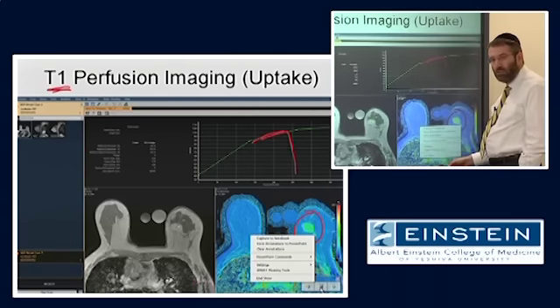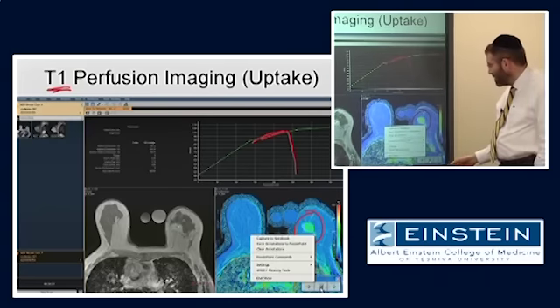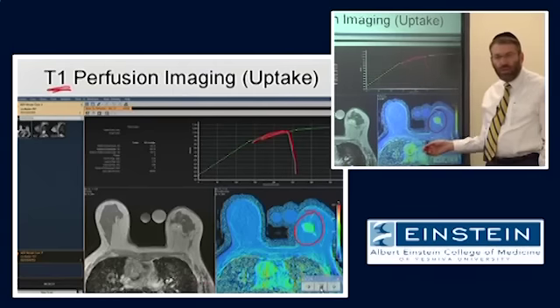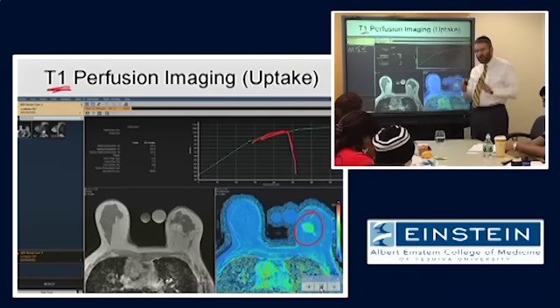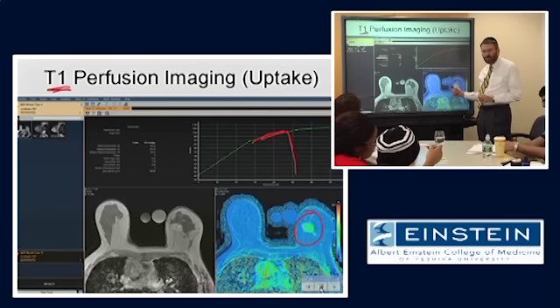The T2 star effects, yes, happen faster? It's not because the T2 star effects happen faster. That has nothing to do with it. It simply has to do with the nature of the pathology. And it's not that the T2 star effects happen in the same time frame. I think that it has to do with the hemodynamic uptake of the tumor. So it's a physiology thing. It's not a physical effect.